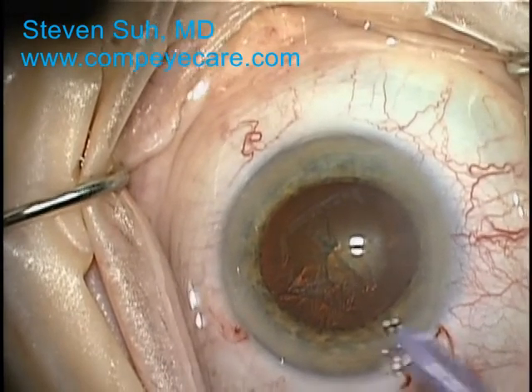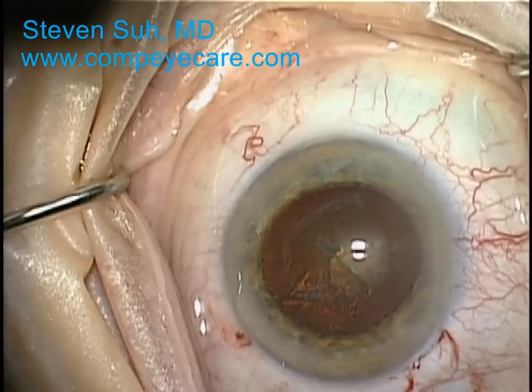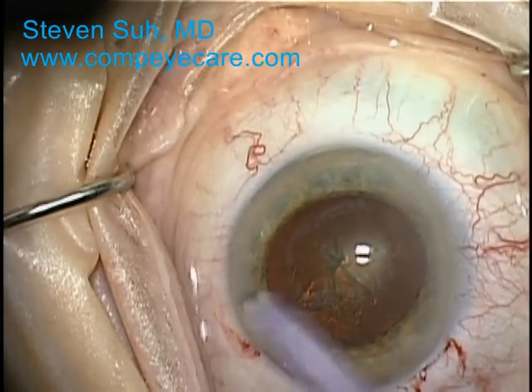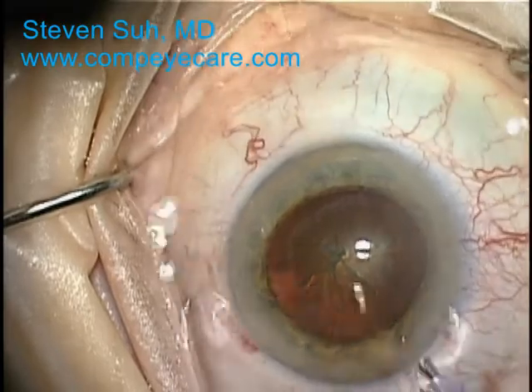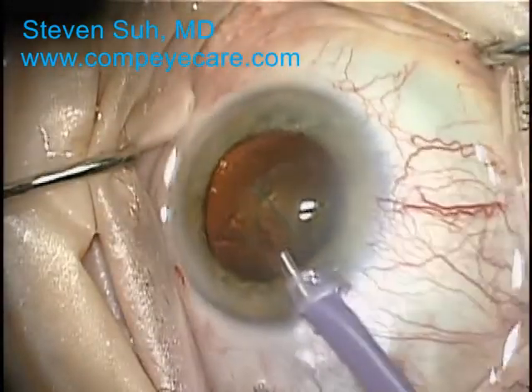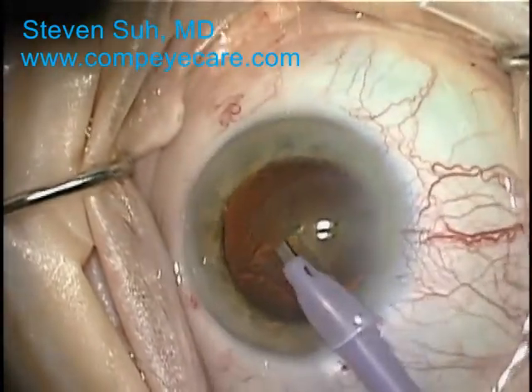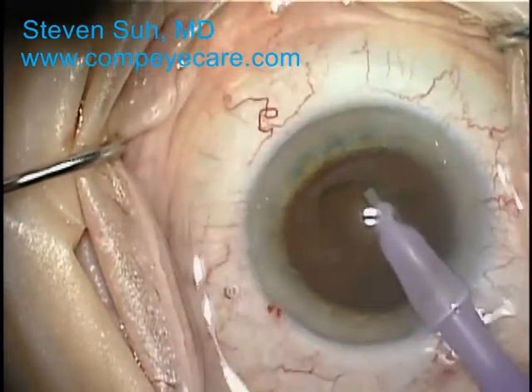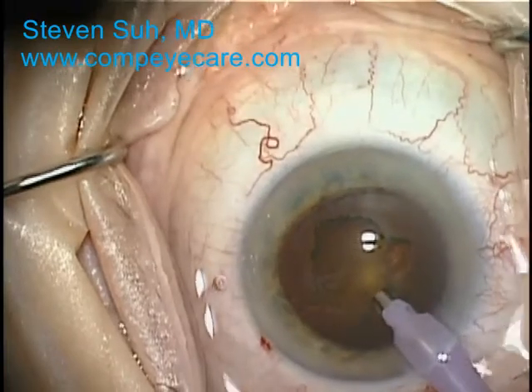In the United States, virtually all cataract surgeries are performed with this small incision technique using ultrasonic energy called phacoemulsification. In some other countries where access to phacoemulsification is not available, cataract surgery involves making a bigger incision so that the nucleus can be removed in one whole piece. Because of this larger incision, the healing time can also be longer.